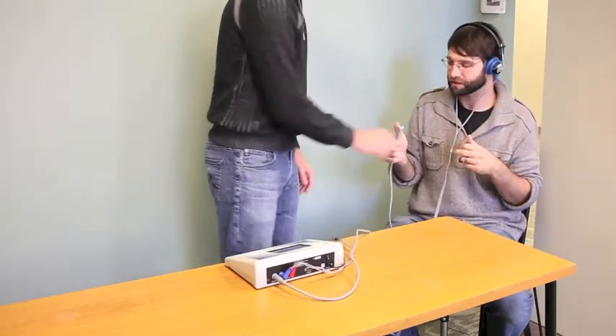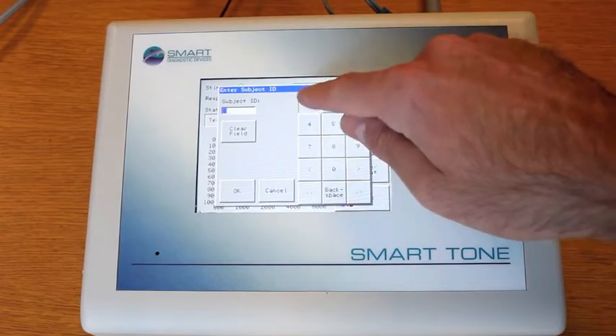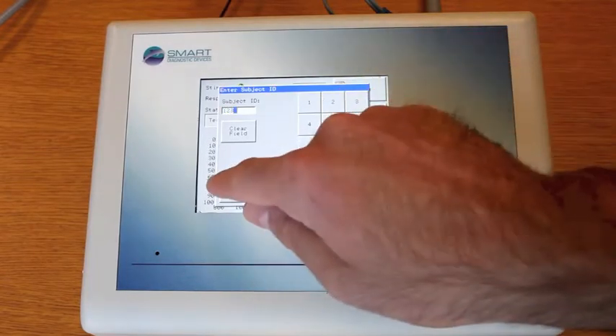Next, when you're ready to begin the test, press the Start Audiogram button on the touch screen and enter in the subject ID.